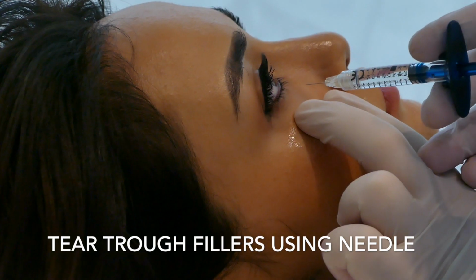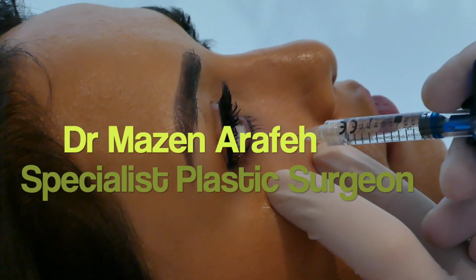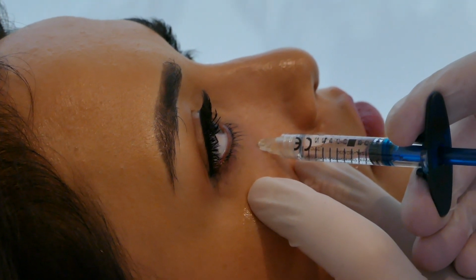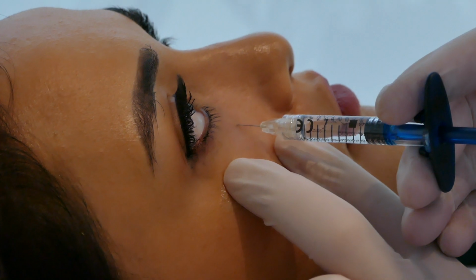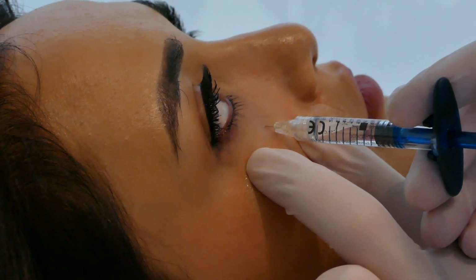This is another tear trough filler using needle technique by Dr. Mazen Arafa, specialist plastic surgeon and expert in facial fillers. So he's using a needle and carefully placing it underneath the muscle, gradually inserting it, ensuring that he pulls the skin with his left hand. The movement has to be very slow and gentle.